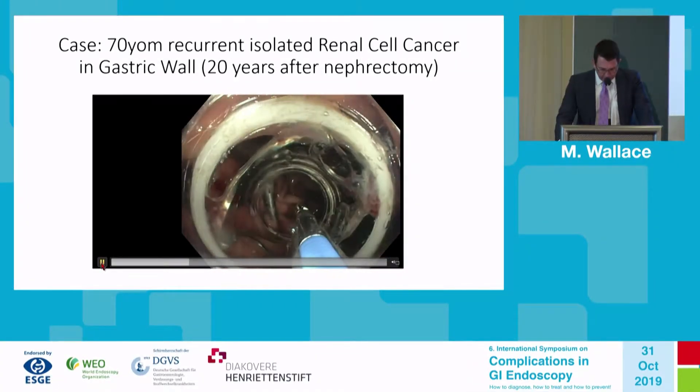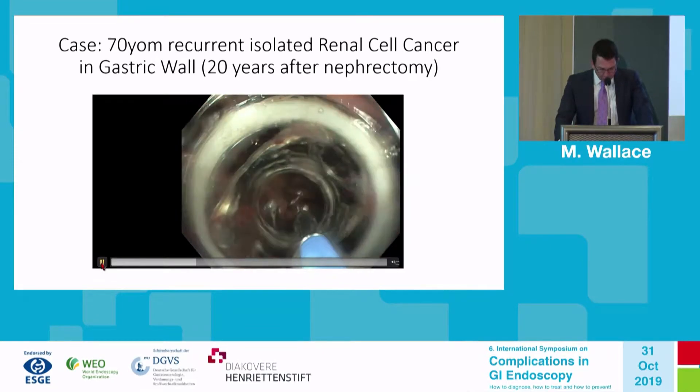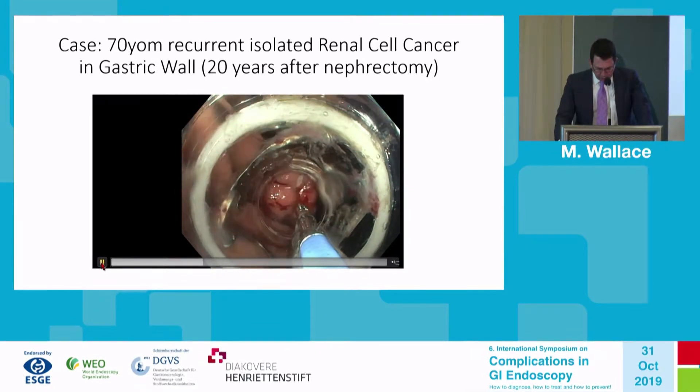That is in the distal end of the cap. You can see here the marking clip and then this small nodule just to the left of the marking clip with cautery marks surrounding that.